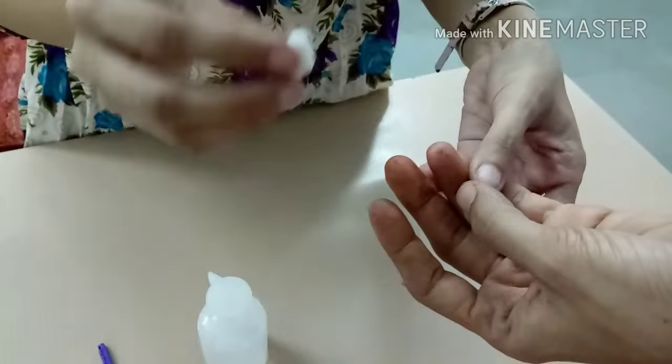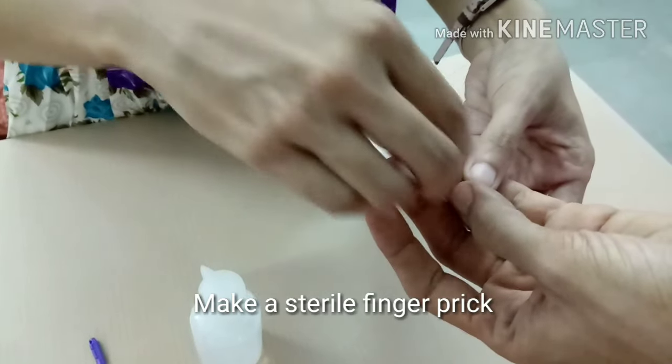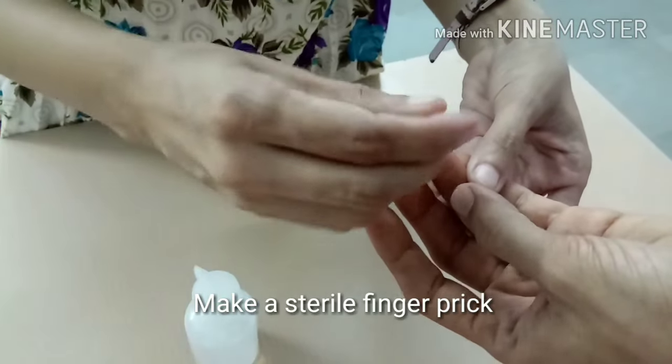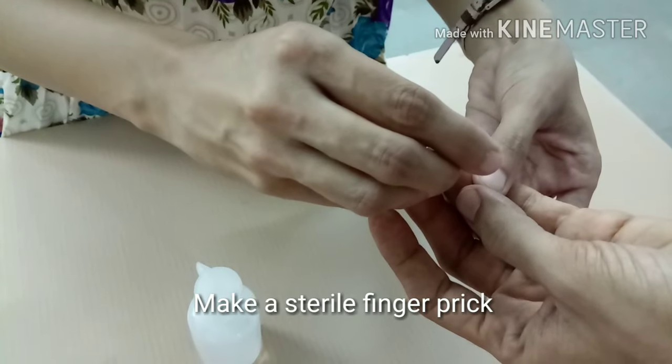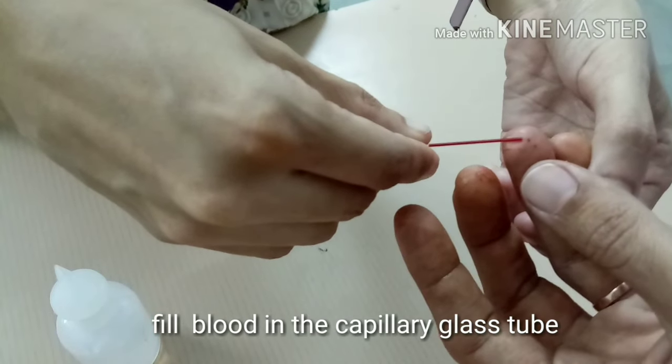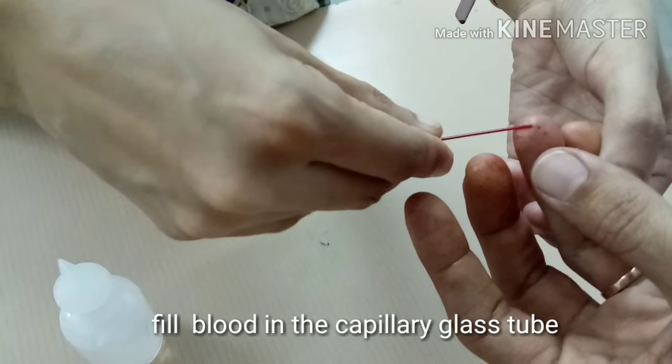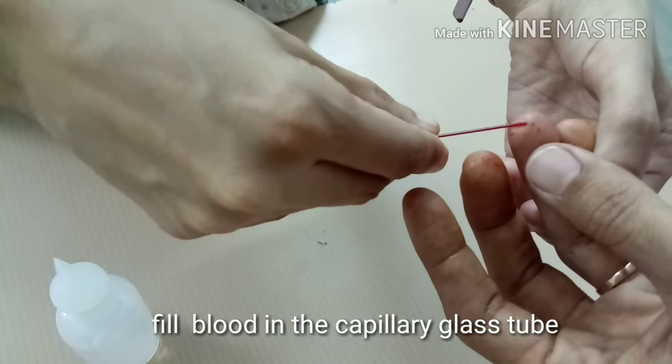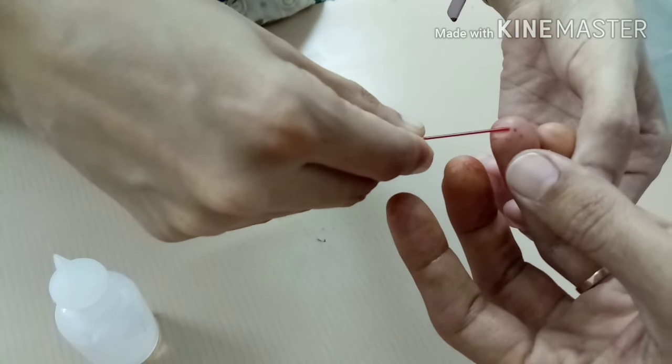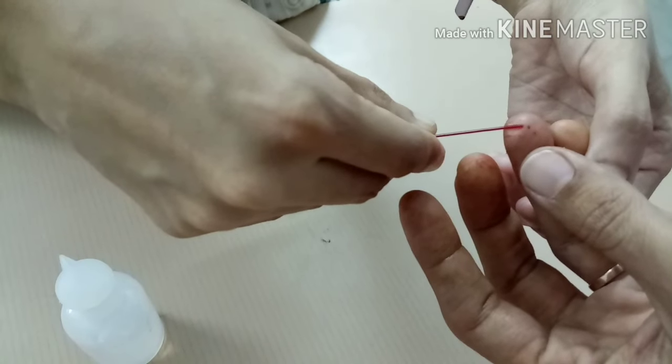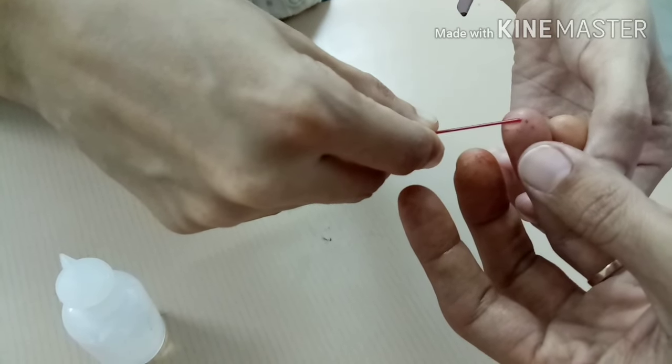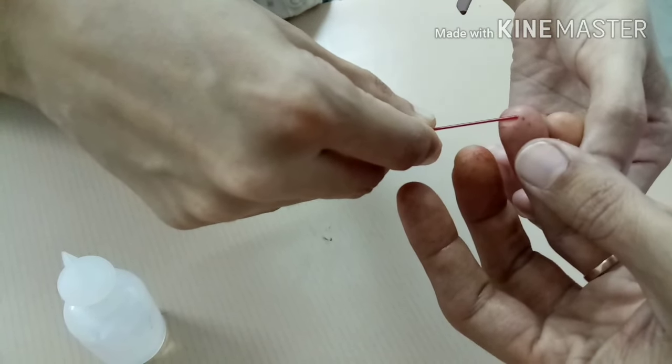Procedure. Make a sterile finger prick about 3-4 mm deep. Introduce one end of capillary glass tube next to the blood drop for the blood to flow into the capillary tube. While doing this, hold the other end of the capillary glass tube at lower level and record the time.